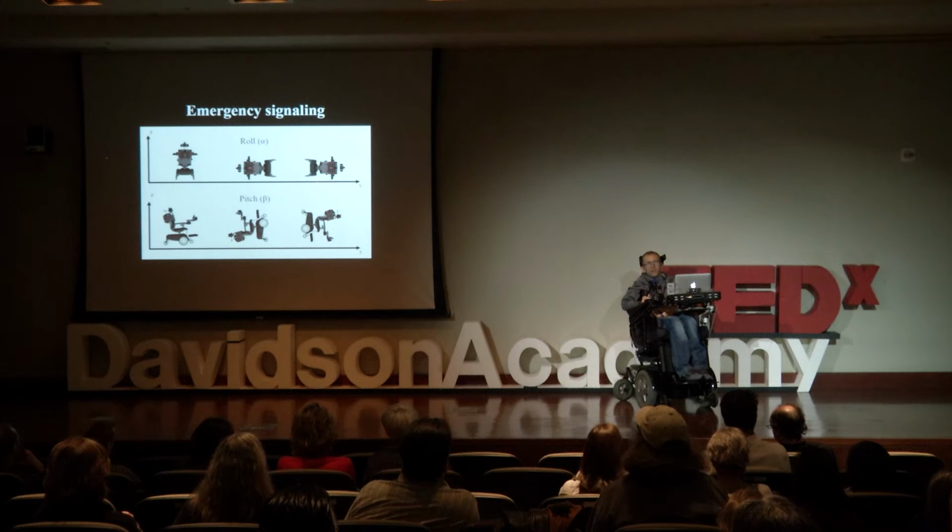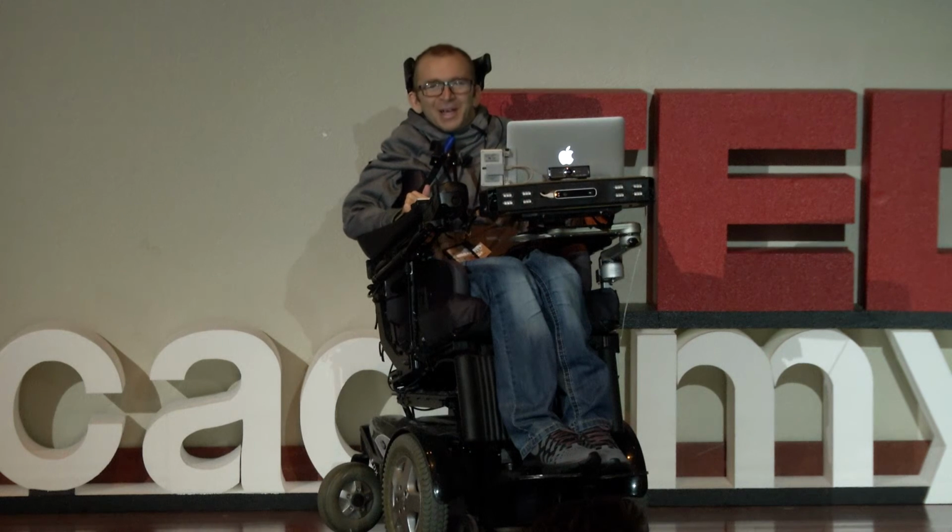That should be annoying enough. People should come to my rescue. And then if nobody's around nearby within earshot, an emergency text message will be sent to the contact lists and local first responders. Okay, next slide, please.